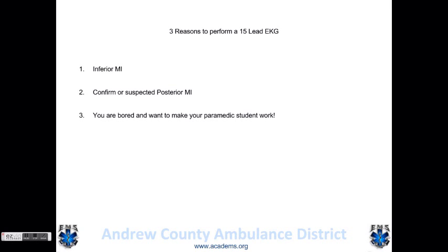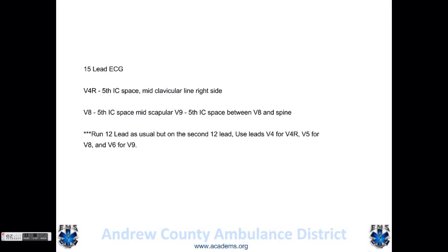So the three reasons are an inferior MI, to confirm or suspect a posterior MI, and if you're bored and you want to make your paramedic student work. Again, inferior MI, still treatable, nitro, all the normal stuff. Now, 15 lead EKG, we're going to do a V4R, which is the fifth intercostal space midclavicular line, V8, V9, and I'm going to show you here in just a second.